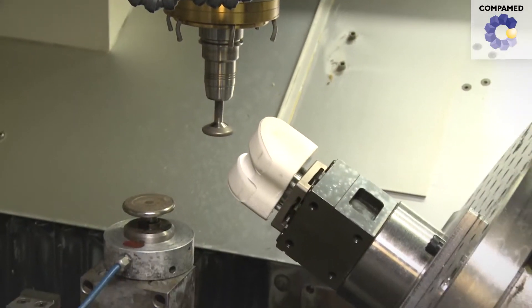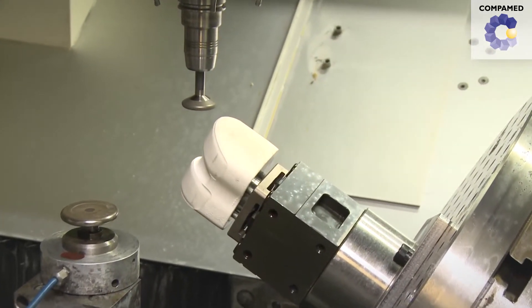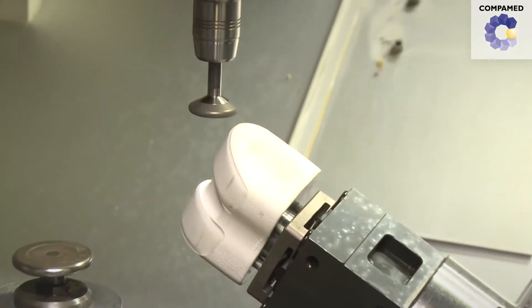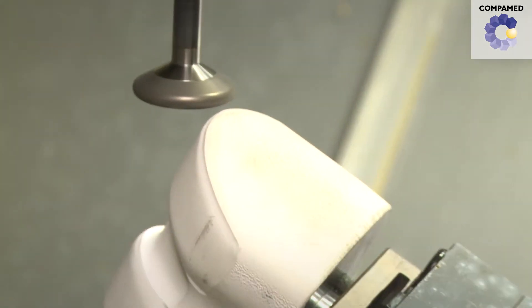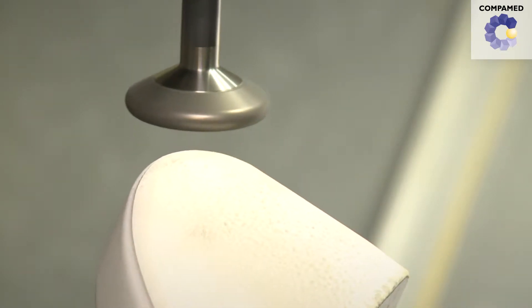We use a simultaneous multi-axle polishing process, utilizing toric mounted points that can be tilted in different directions, making the process very flexible. Thanks to this grinding process, we are able to achieve surface roughness of 0.1 micrometers.